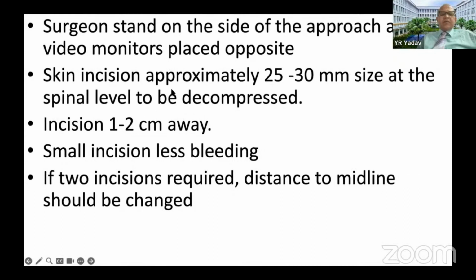The skin incision is approximately 25 to 30 millimeter in size at the level of pathology, and it is about 1 to 2 centimeter away from the spinous process, away from the midline. The small incision is preferred because there is less bleeding.